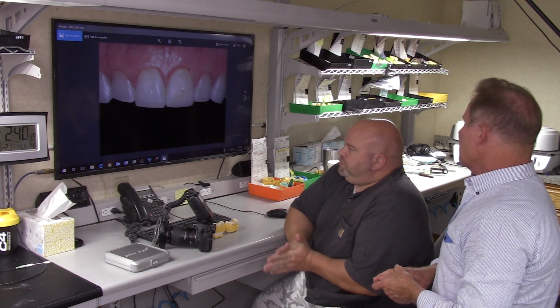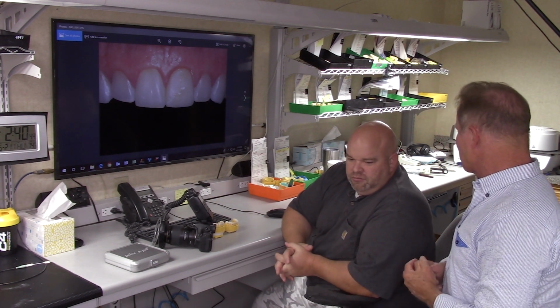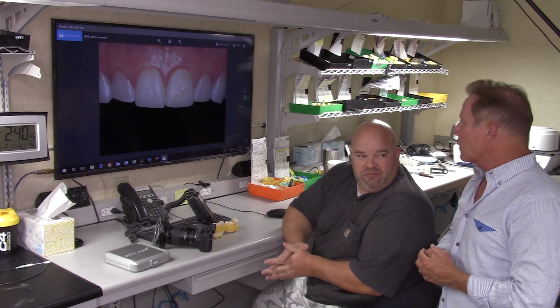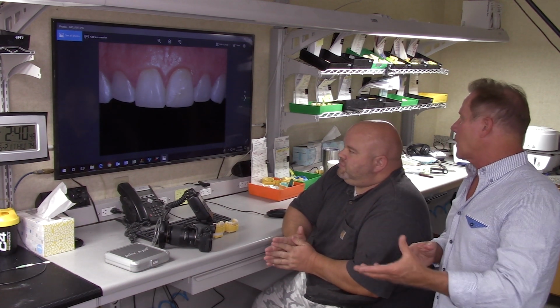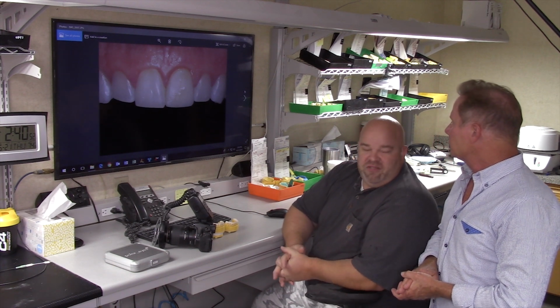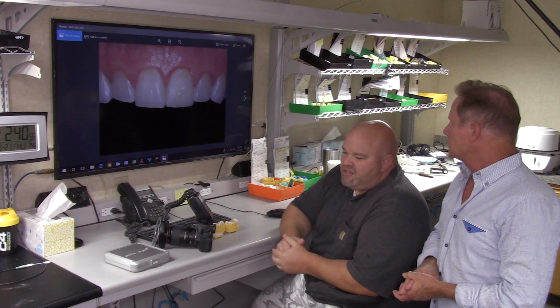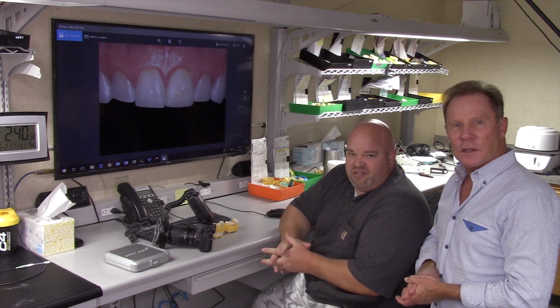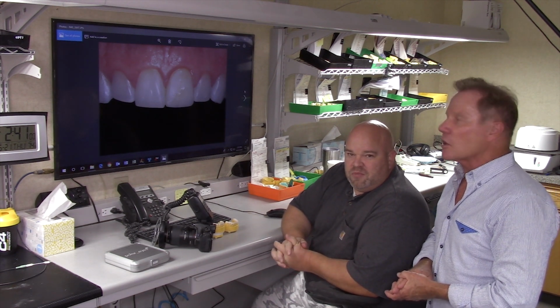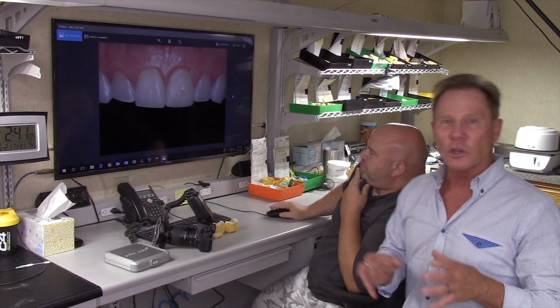Now, Phil, I know that matching a single central or adjacent natural teeth is probably one of the most difficult things you do, right? Absolutely. Okay. So photography, how important of a tool is that for you? We gain most of our information from photographs. And the quality of the photographs, the doctors that send really good photos, it helps us tremendously. Okay, good. And you can see he's got a 50-inch TV screen, so it's blown up multiple times.